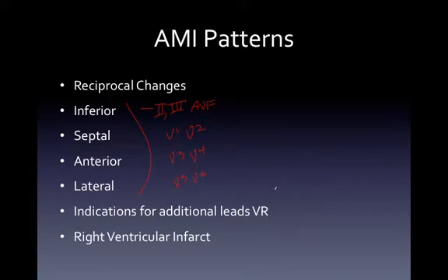We're also going to look at the indications for doing the VR leads or the right-sided leads, and we're going to take a look at what's different between a right ventricular infarction and a left ventricular infarction.